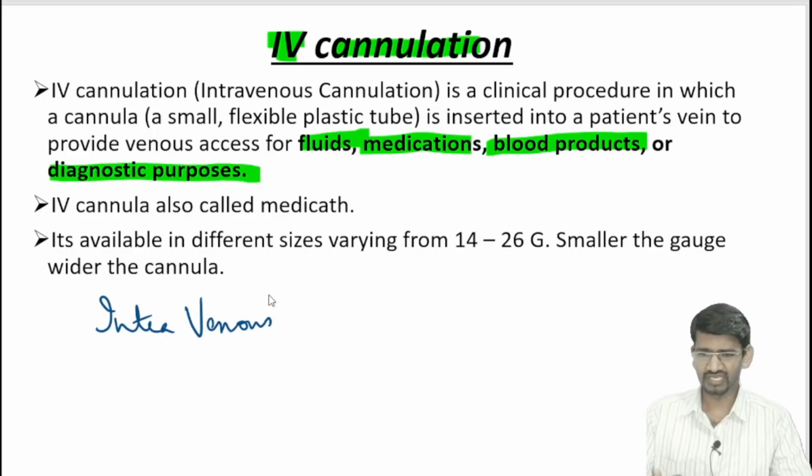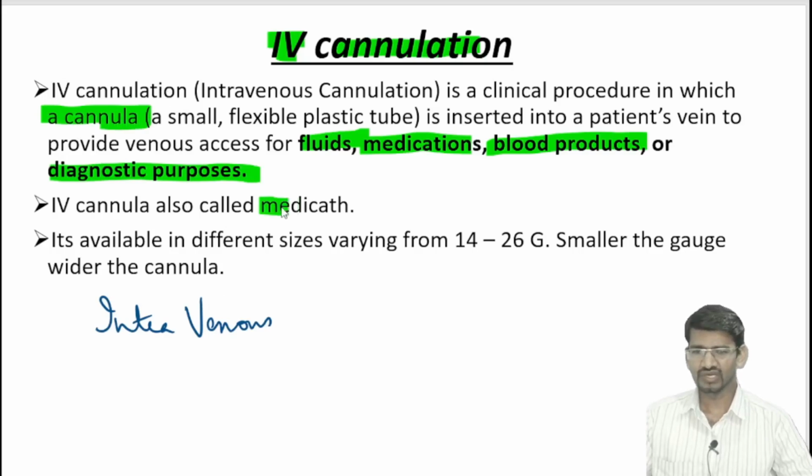This small flexible tube itself is the IV cannula, used to have access into the vein for administration of fluid, medication, blood and blood products, for some diagnostic purposes, and sometimes even to draw blood. The IV cannula is also called a medicath.